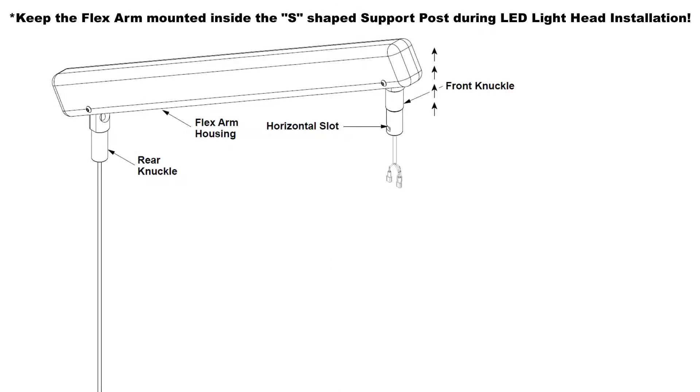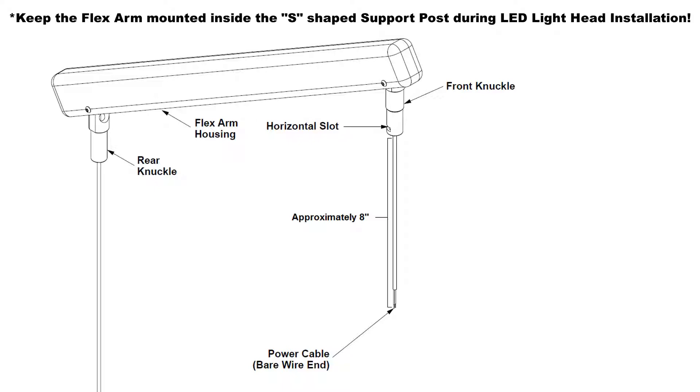Pitch the flex arm up slightly, then pull the old halogen wiring harness through the flex arm front knuckle, making sure the LED wiring harness is traveling along with it as you pull. Once the halogen wiring harness is fully removed and the LED wiring harness has replaced its position in the flex arm, detach the two wiring harnesses from each other. Pull the bare wire end of the LED wiring harness through the front knuckle of the flex arm until there's approximately eight inches of wiring harness exposed from the bottom of the front knuckle.